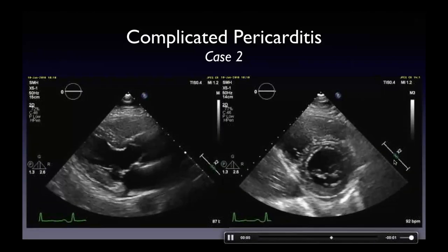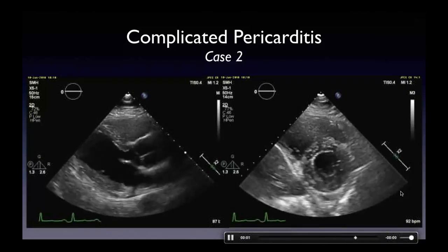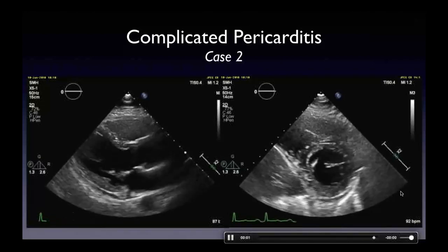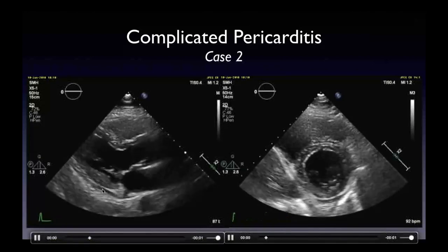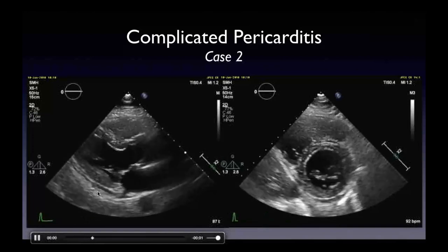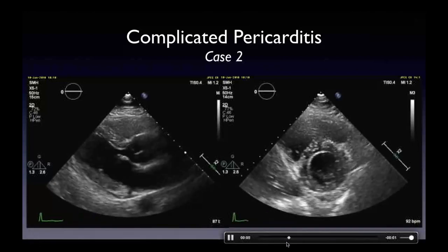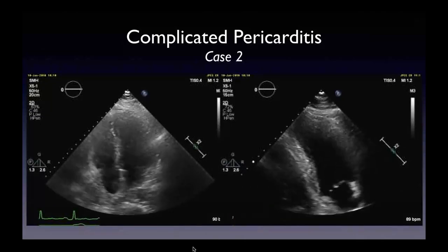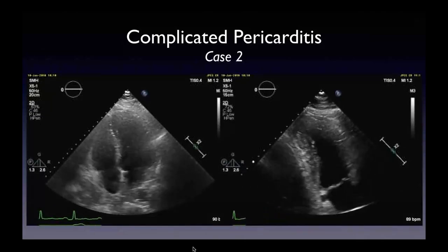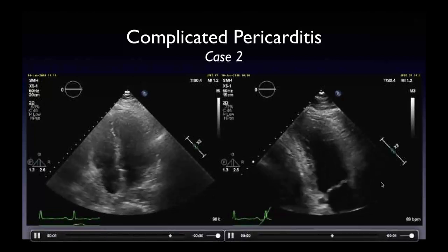And here is his echocardiogram with the third admission overall, the second recurrence of pericarditis. Here there's really just a trace pericardial effusion. You can see it below the inferolateral wall, so posterior to the left ventricle. You don't really see much anterior to the RV. You can see that on the short axis shown on the right as well. In the apical 4 and apical 2 chamber views, once again, there is low normal LV systolic function, ejection fraction probably 50 to 55%. You really don't see the pericardial effusion with these views.